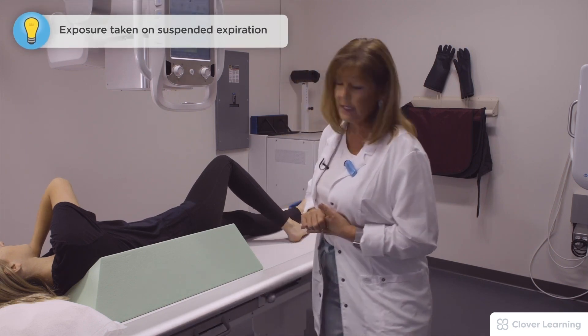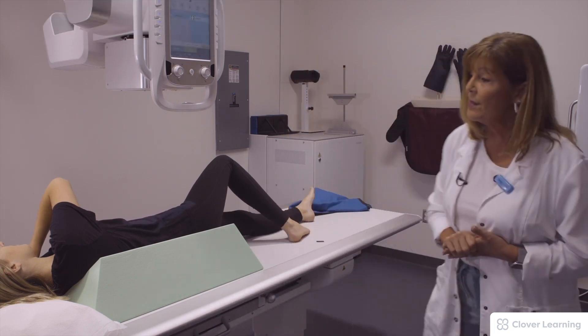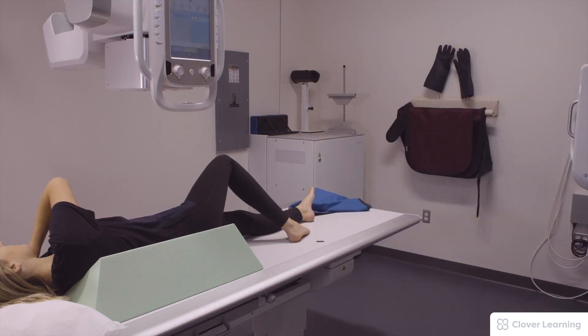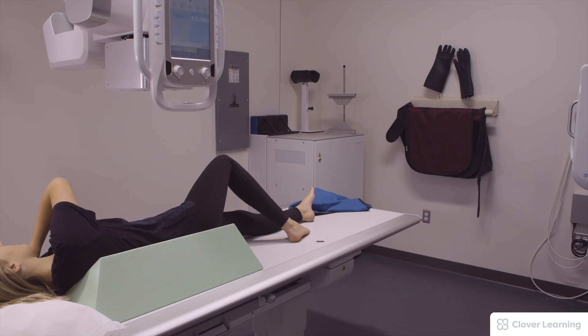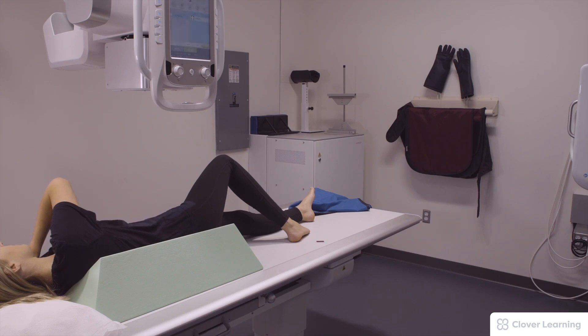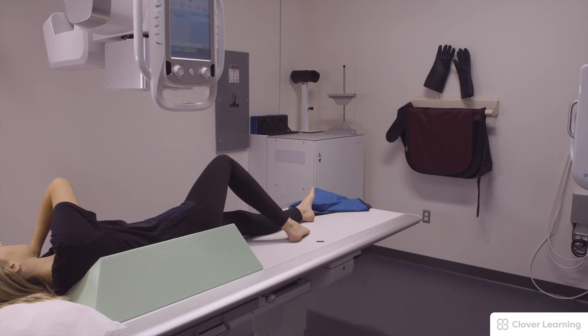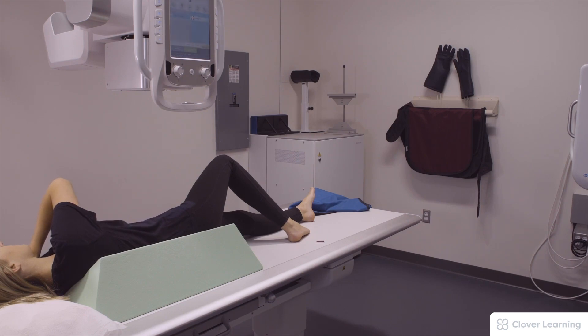Patient, please take in a big deep breath and blow your breath all the way out. Hold your breath, don't breathe, don't move, and the exposure is taken.